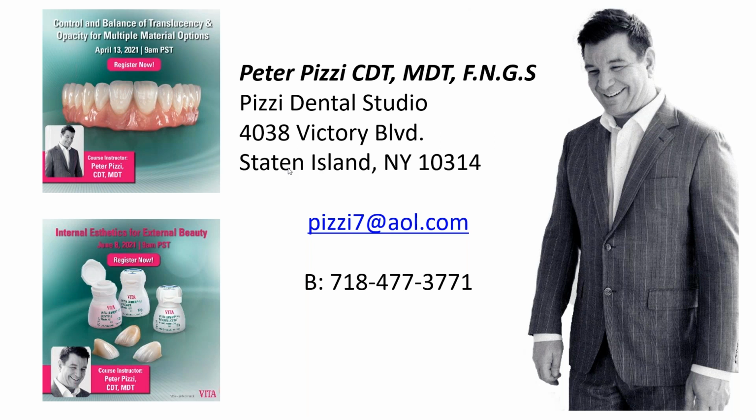And it made me figure out that I couldn't do it the way I would normally do it. Normally I put a little bit of dentin in, some mamelons, and then I tried to get my frame. By the time I was done, I had no enamel because I had no space left. And I had to keep taking away and figuring out what directions to go. So I'm sorry to be cold, but photography is the key to the communication.